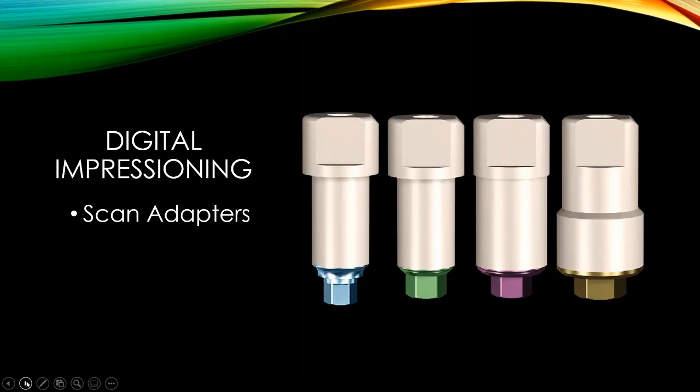So now our implant's in position, implant's healed, and it's time to impression. Following through this digital protocol, we're going to go through this process in the pure digital workflow, which is scanning that implant. So now we're scanning with scan adapters. These are all provided by Implant Direct.